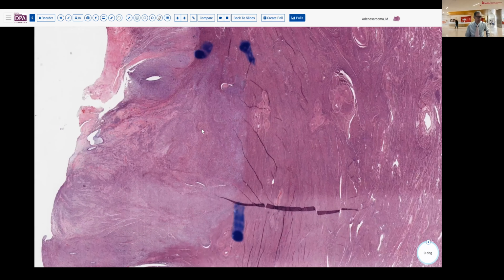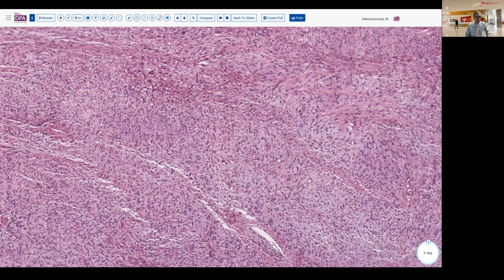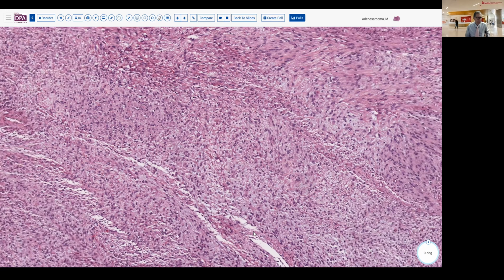And as we see here, it has areas that look like they are bulging into vessels. It's a mesenchymal lesion with a sort of sarcomatoid pattern. It's not a really ultra high grade anaplastic type sarcoma, but it's certainly reasonably cellular and somewhat spindle and epithelioid appearing.